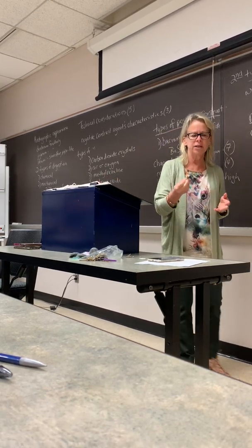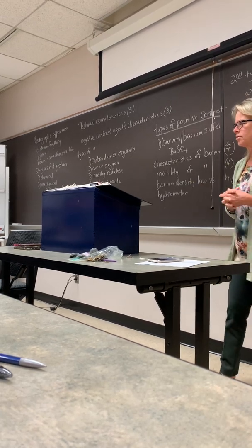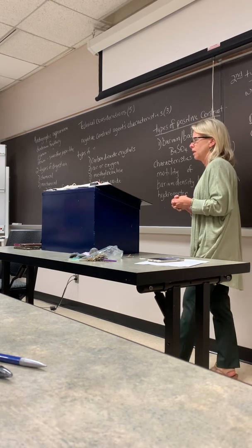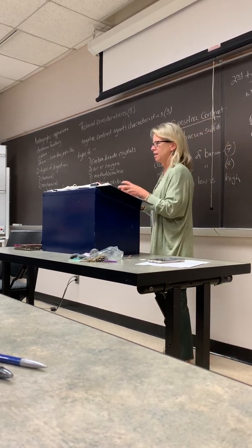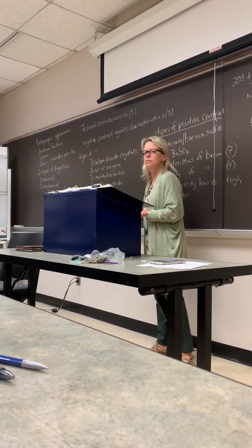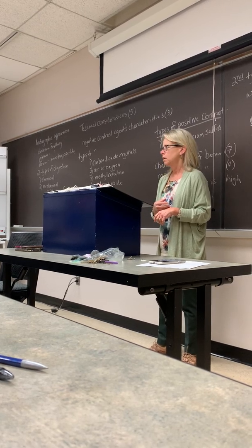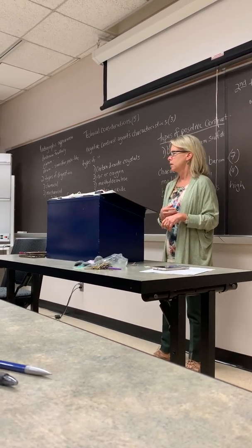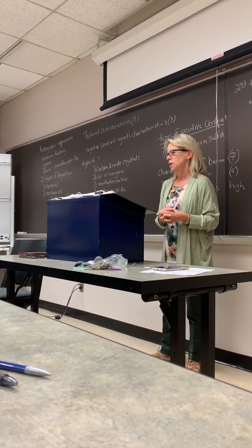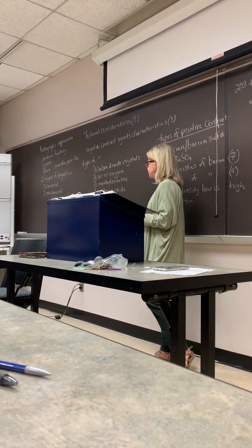It's a material called methylcellulose. It's this thick, clear stuff. Have you seen it? Yeah, we use it in the office. It's gross. Yeah, it's really gummy. I didn't think they used it much anymore. They put it in bread and stuff. Is that what they put in the bread? That's barium, I believe. So it's sticky and it's like a liquid. It's like water, but it looks like a clear gel.